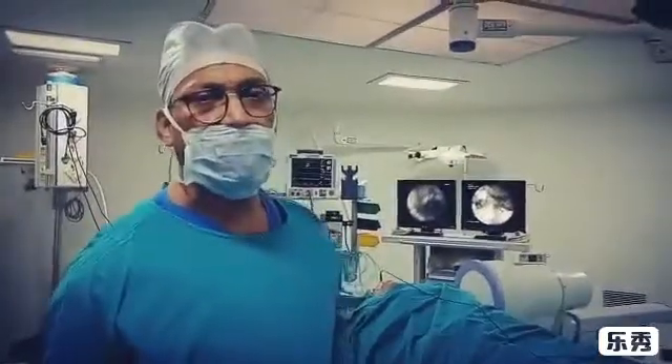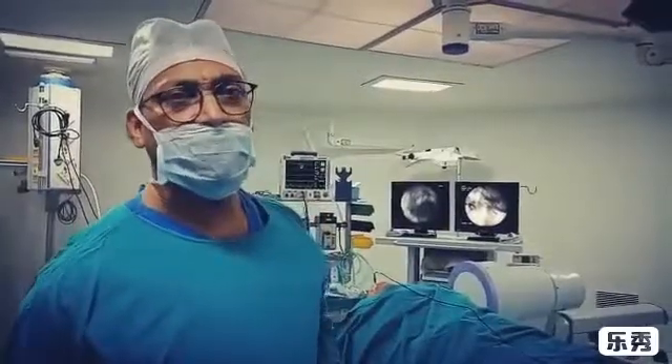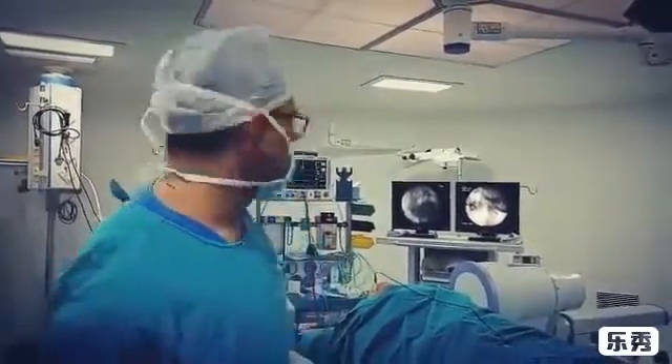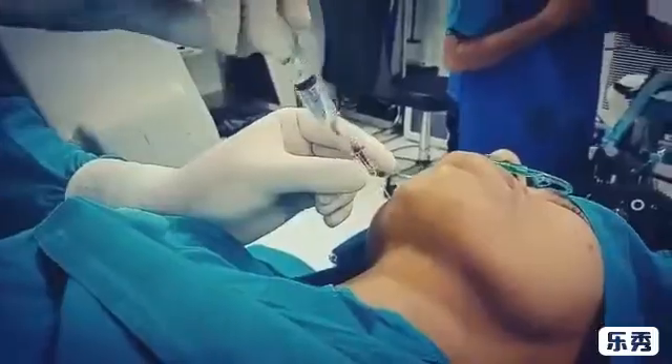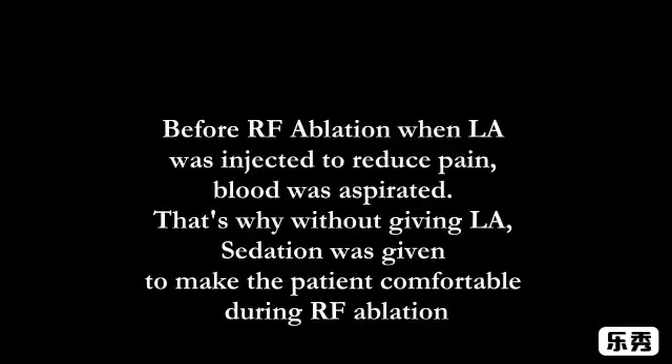Now we go for conventional radiofrequency ablation at 75 degrees centigrade for 75 seconds. Usually local anesthesia is given before RF, but here blood was aspirated. That is why we have to give a little sedation so that the patient can tolerate the heat of the RF.